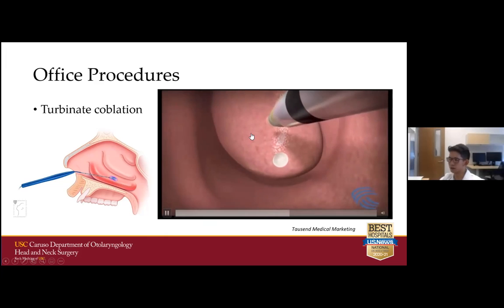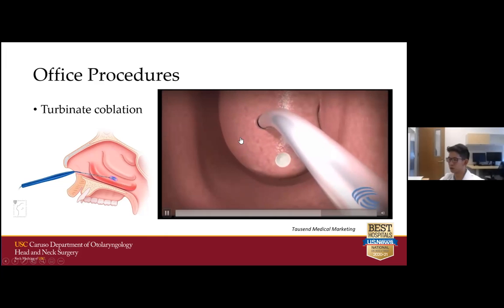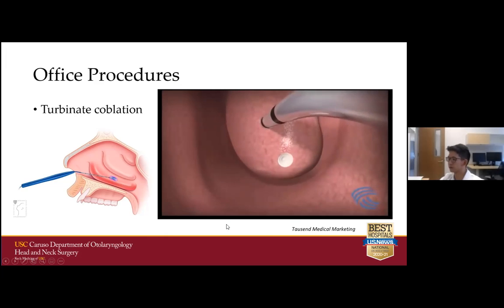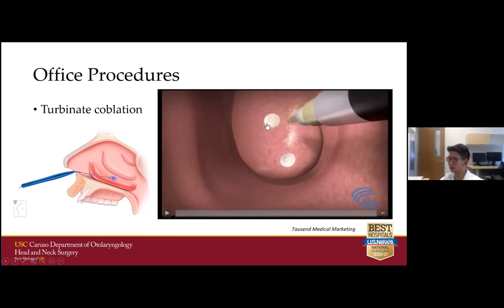Depending on the size of the turbinate, it'll take 2 to 3 passes. Here, this person is going in slightly above it to reduce the swelling of the turbinate. Obviously, the swelling is reduced, and it allows greater room for airflow through the nose. Just coming out and reducing it more. Because the tip of the probe is where the coblation occurs, you draw it back to certain lines on the device and vaporize a little bit more, and a little bit more, and it reduces the turbinate along its trajectory from the back of the nose to the front of the nose.